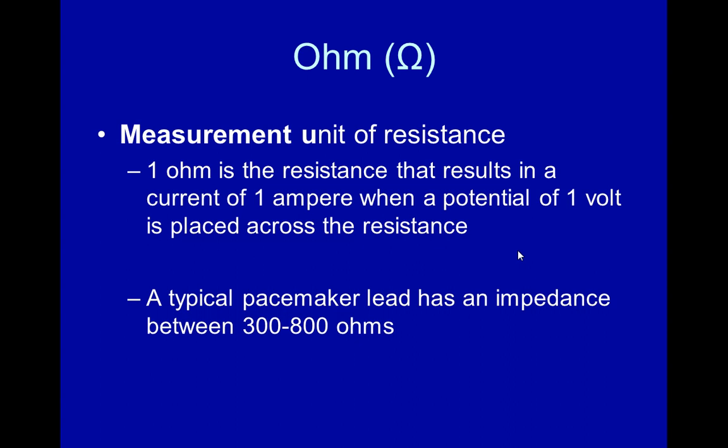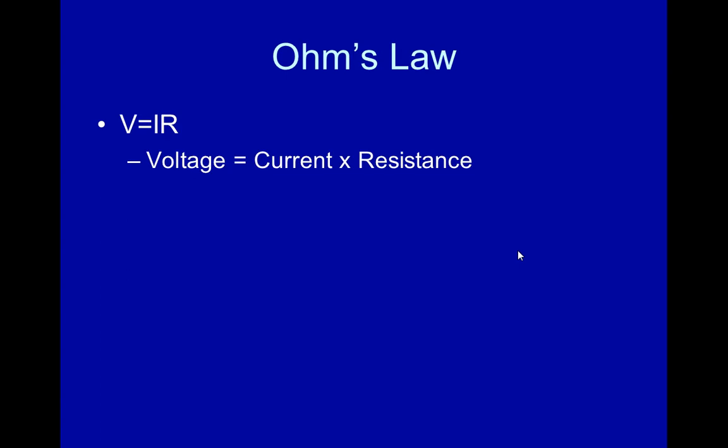But the bottom line is when we interrogate our pacemakers, we're going to look at the impedance of the leads, and we're hoping to see a pretty consistent pattern over time. When there's a significant increase or decrease in the impedance of a lead, we will then know that there is something wrong with the lead, whether it's an insulation issue or a conductor issue or a connector pin issue. Hard to know for sure, but there's usually a way to figure that out. But we will be looking and talking impedance a lot.